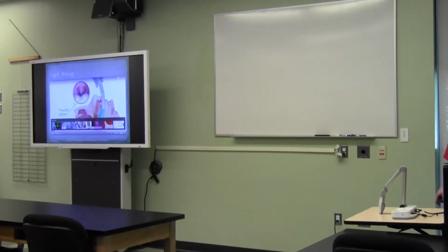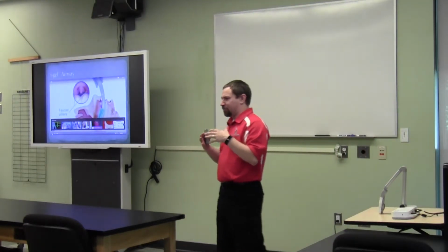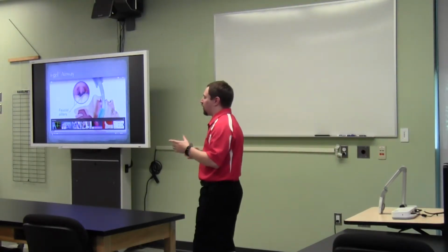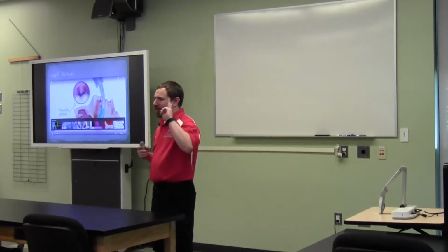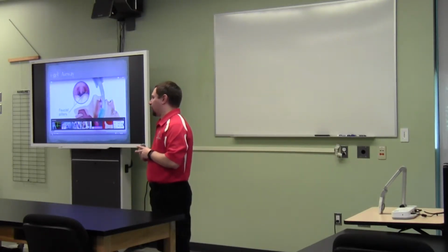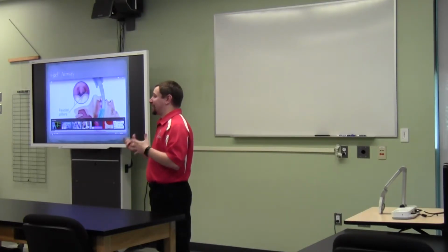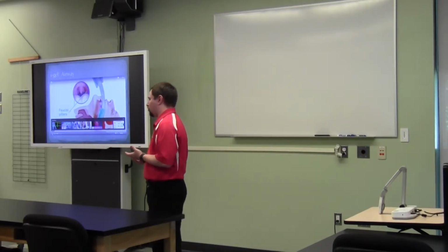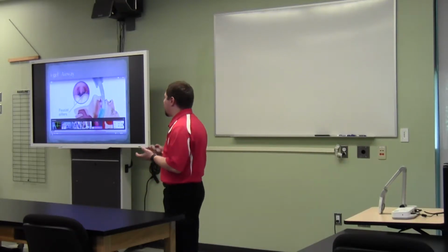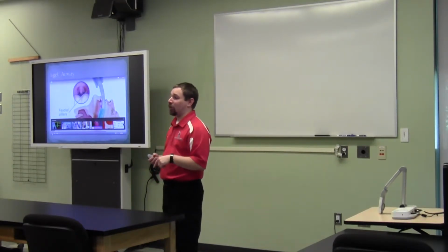Okay. So, very good control. It's a very nice device, and it's getting used to it. It's just getting more traction here in the U.S. Downside is you saw that it took 2 people to put this airway in. That is its big drawback. As nice as it is, it does really need 2 people to place it properly, because it's designed for a surgical environment. But right now, it's being shown as one of the more gold standards of the supraglottic airways.